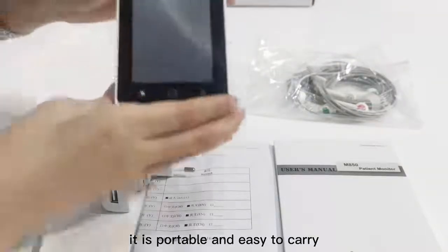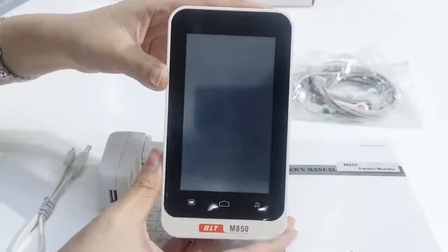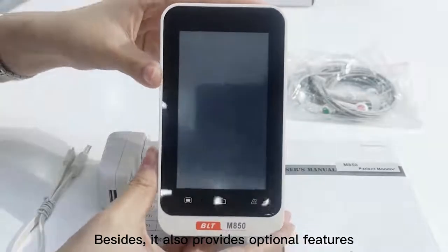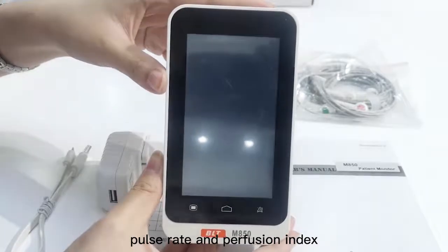As you can see, it is portable and easy to carry, which provides accurate measurements of ECG and respiratory rates. Besides, it also provides optional features, including the SPO2, pulse rates, and perfusion index.